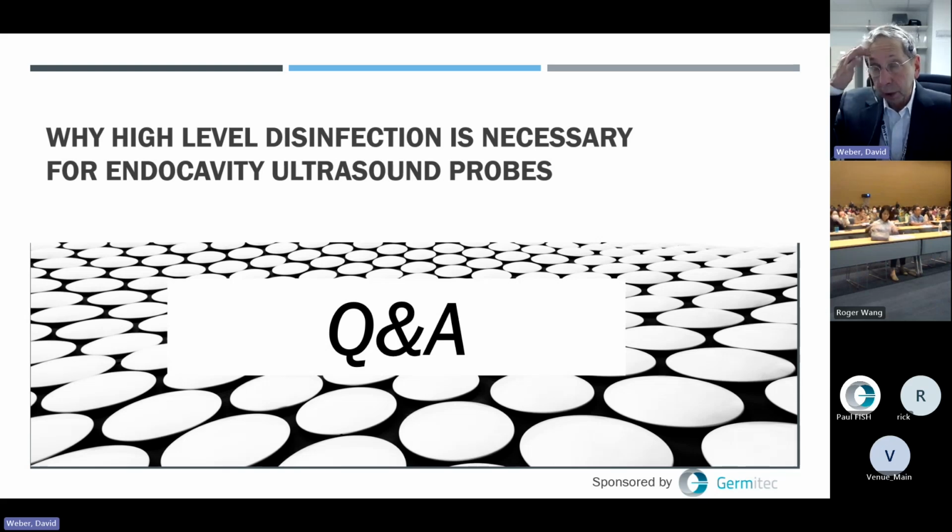It's quite efficient because ultraviolet light falls off in terms of energy as the square of distance. So for disinfecting a room, you need very large bulbs and/or long-term exposures. But when you put it into a chamber and the bulbs are just mere centimeters or less away, you can get very rapid disinfection of organisms.